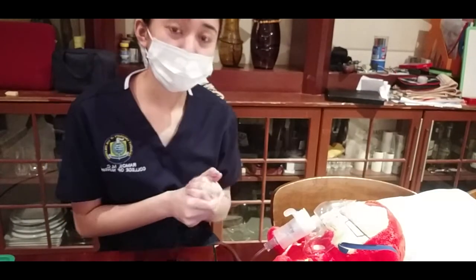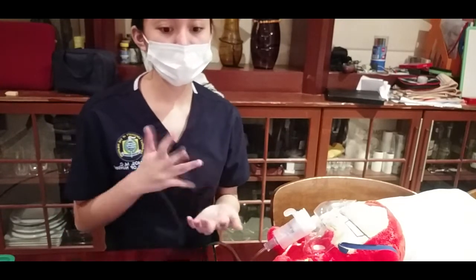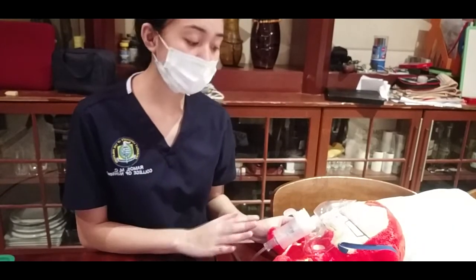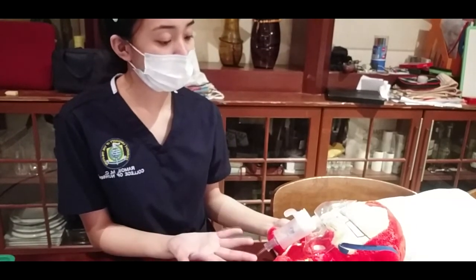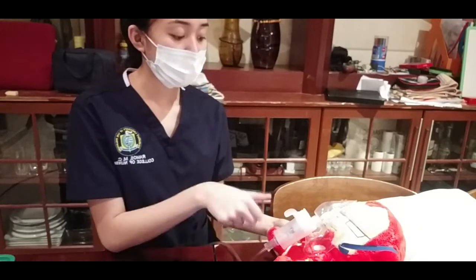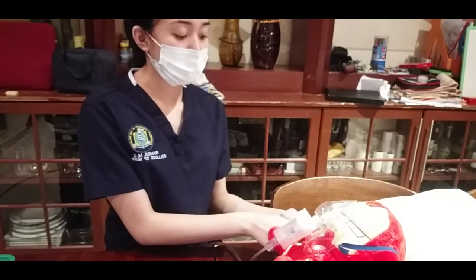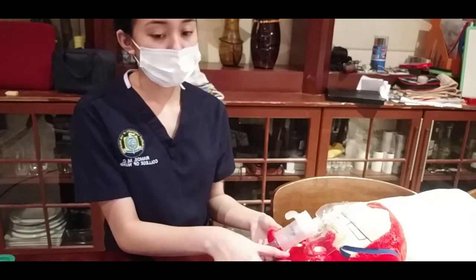And lastly, we will be evaluating the following criteria: the oxygenation and perfusion, arterial blood gas, and the mental status. And we could do that by checking the RR of the patient or checking if the patient is cyanotic, and we could also be checking the nails of the patient to see the blood circulation and also the mental status.